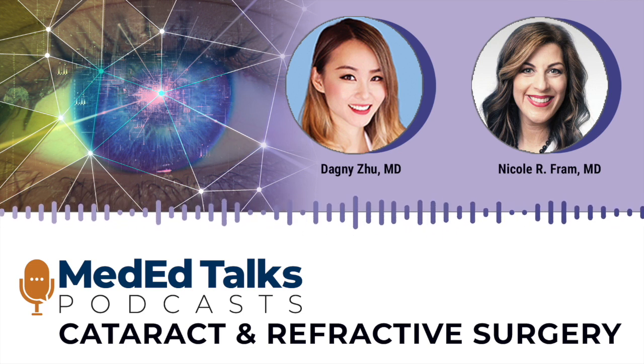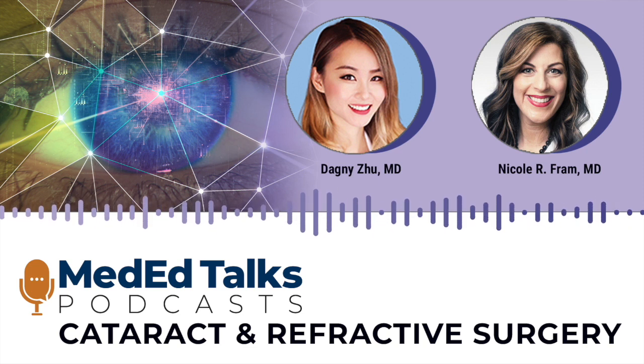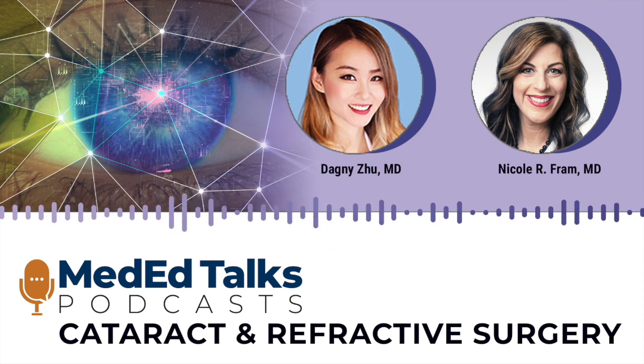And so I think in those patients that have normal placido imaging, but you can see the EBMD paracentral, I would think that epithelial mapping would be very beneficial. So that's a great point. Yeah, and then you can monitor them for stabilization as well.